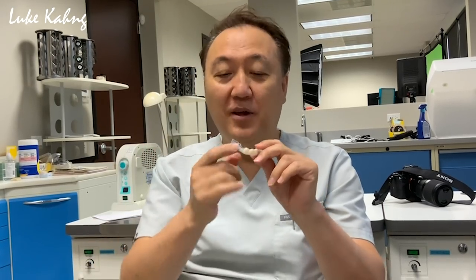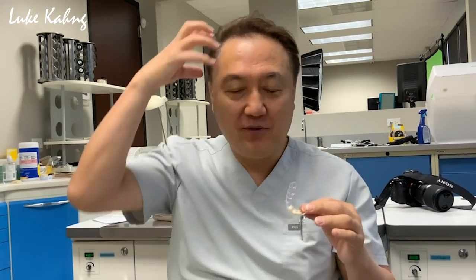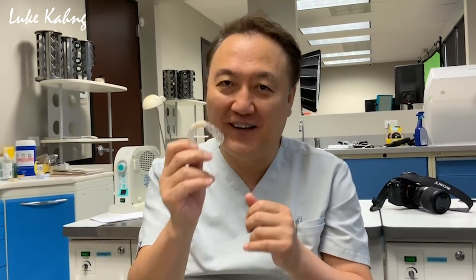Usually this denture tooth is a one-tone color, and it did not match the patient's teeth. But this one is covered, though for that 10-20% of patients who are demanding about the color, we have to make something more special, which is pulling our hair. This is very tough. This is a temporary, probably 5-6 months, and they wear it.